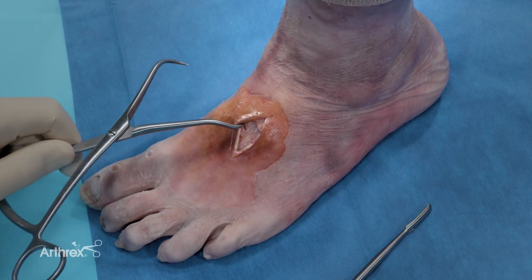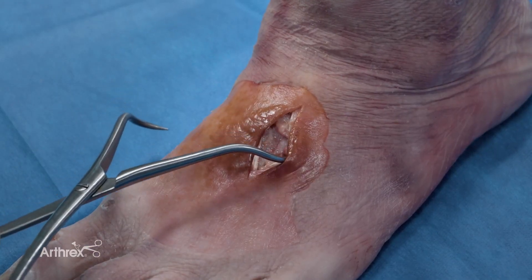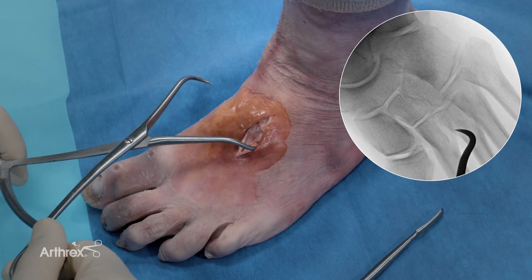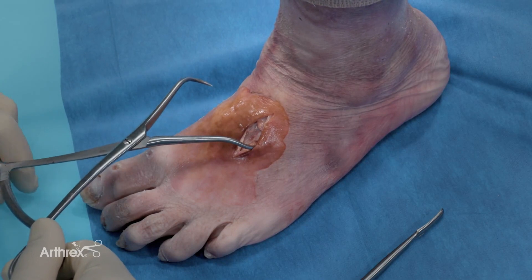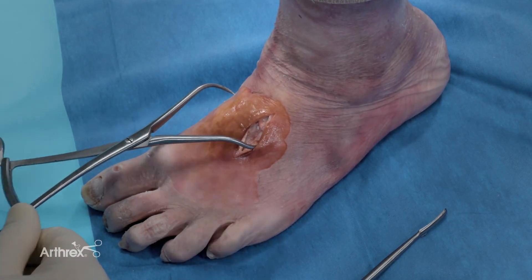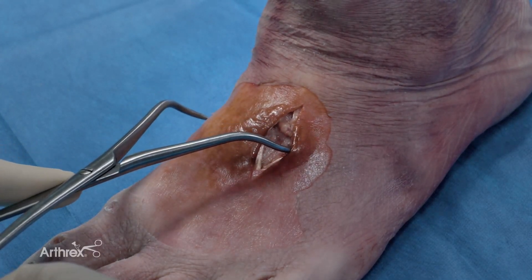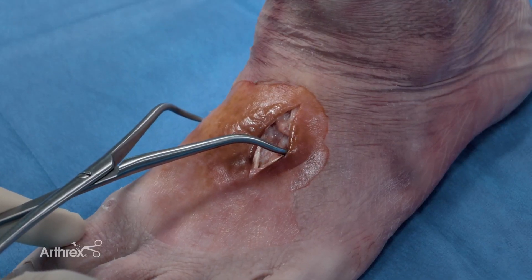After exposing the Lisfranc joint and cleaning out any scar tissue, the next job is to reduce the Lisfranc joint. This is done with the use of a Weber tenaculum and I typically place the tenaculum slightly proximal to where my wire is going to go. I also hold on making my medial incision until I've placed my wire through the medial tissues, then I open and make sure that I'm making my incision in the right spot. Once I place my Weber tenaculum laterally, I clamp down and typically aim to clamp around the tubercle on the medial cuneiform, which you can see in the fluoroscopic image. If there is mild sagittal plane instability, I would reduce the second TMT joint by moving the tenaculum slightly more dorsal on the metatarsal base, which will allow me to push down and hold that reduction when I clamp.